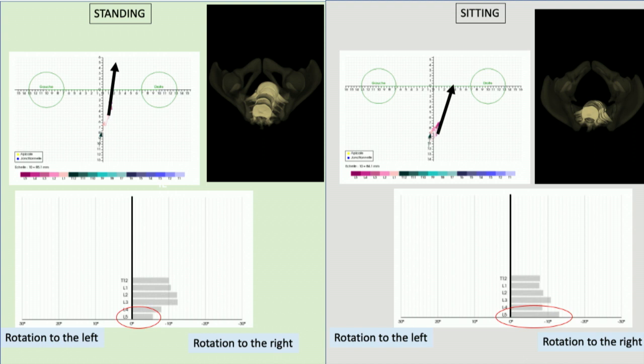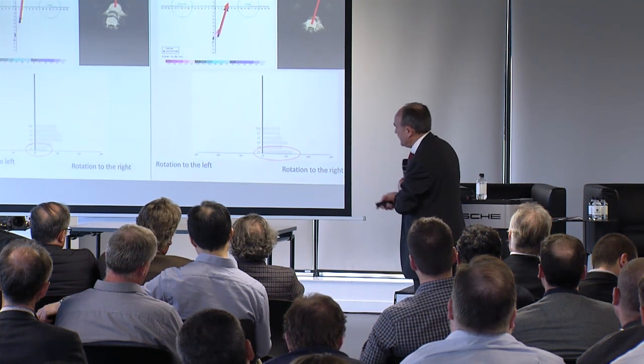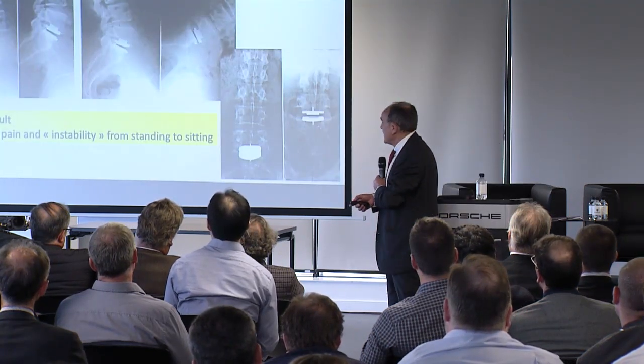And probably it was our hypothesis, the explanation of this strange feeling of instability. So we revised this patient, and just after the surgery, he had significant relief of the pain. And you see here very well this orientation of the vertebra. You may be not convinced by this, and I present you another case.